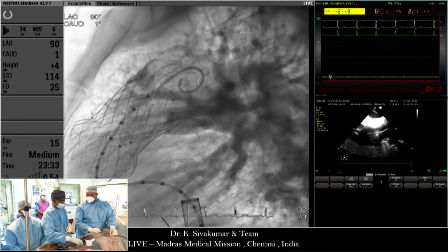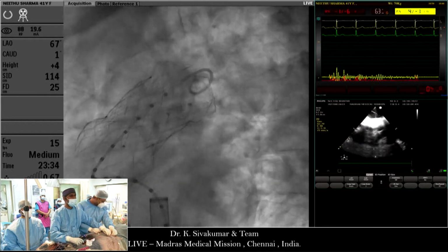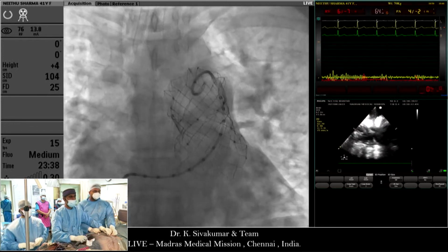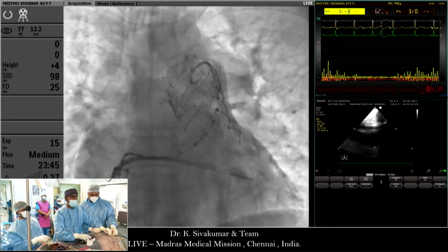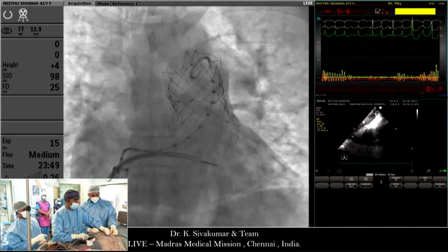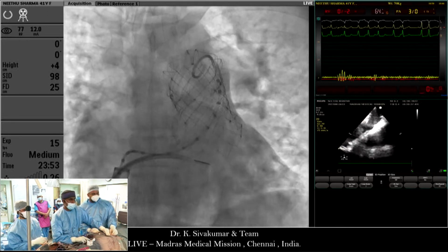Yeah, come to AP. Show the echo bigger. Echo big.